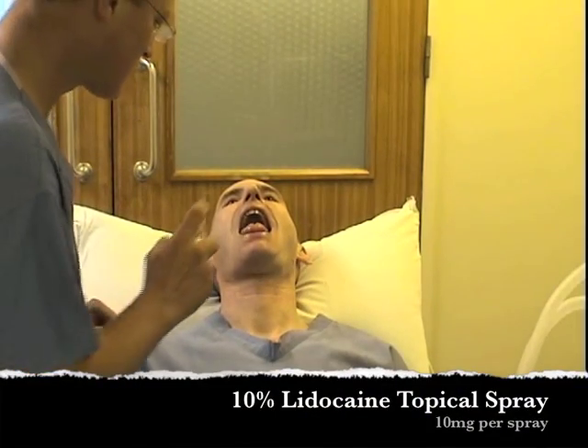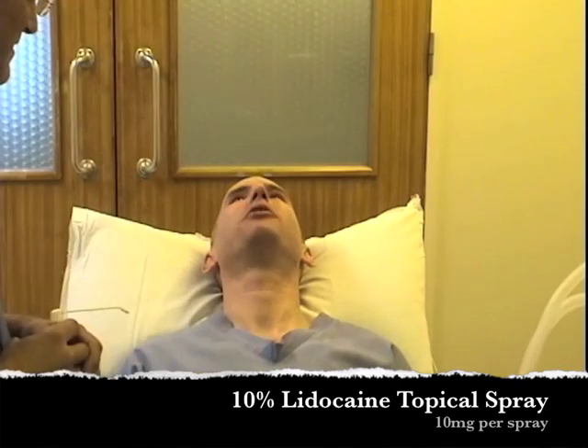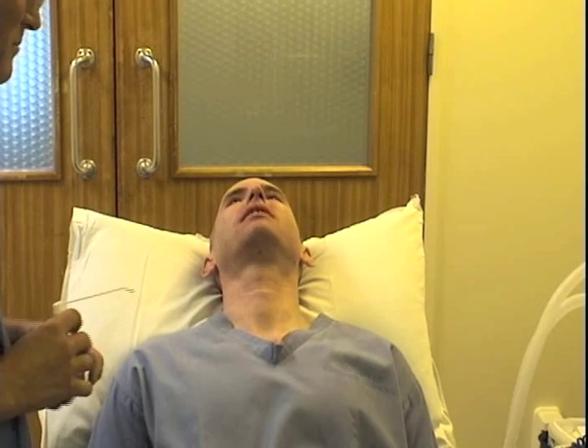Are you ready? Press your head back, open your mouth, stick your tongue out — it tastes a bit like banana. It doesn't matter if you swallow it.